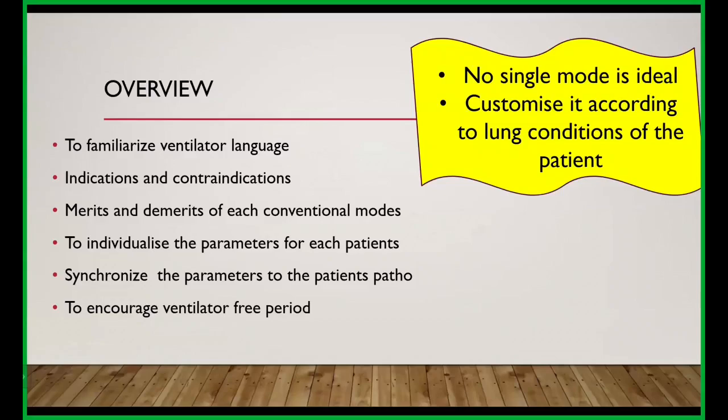And here we see the indications and contraindications of each mode, merits and demerits involved in each mode. You have to set parameters for each patient according to the mode given, and also synchronize the parameters to the patient's lung conditions. These are done only to encourage a ventilator-free period, that is ventilator independence. That will define the success of your ventilation.